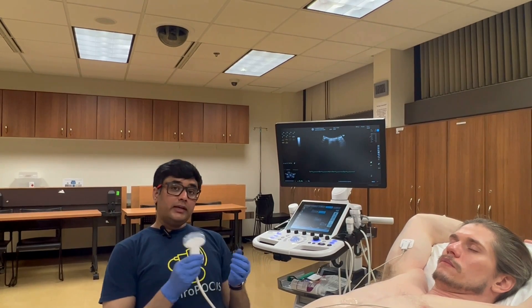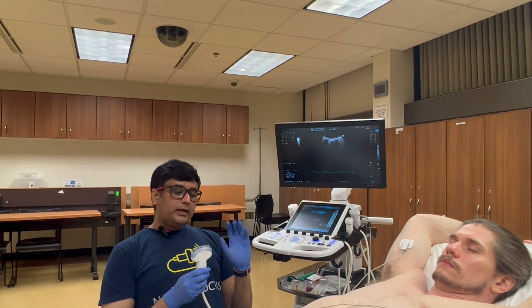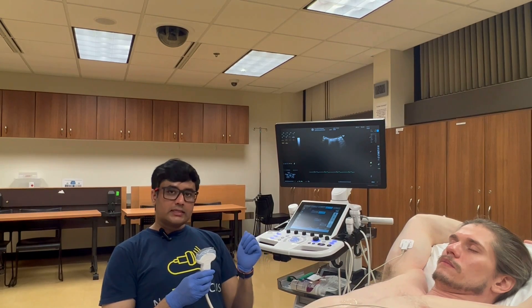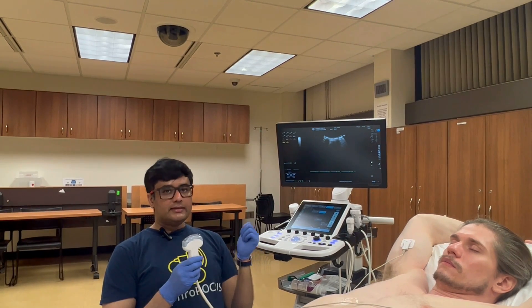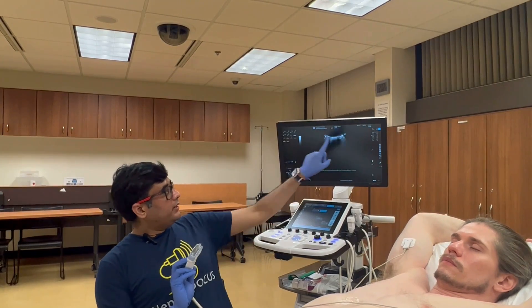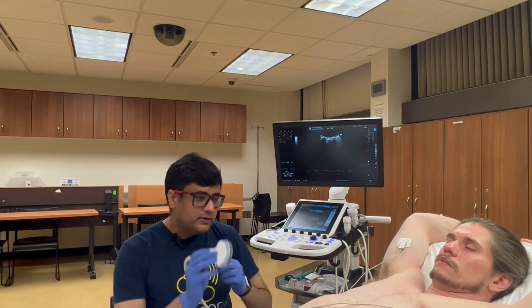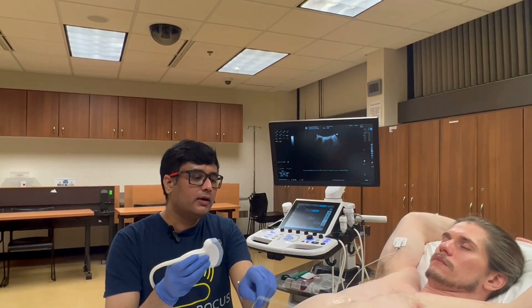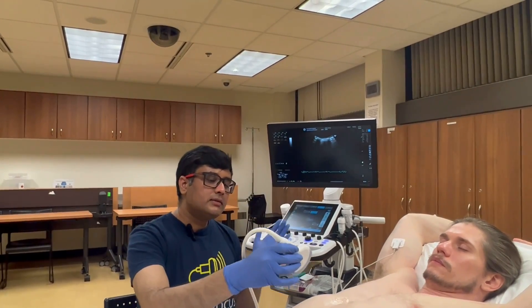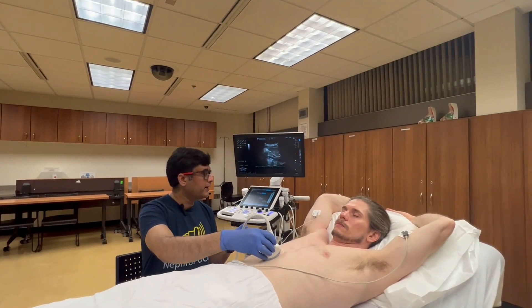When using the curvilinear transducer, put it in the cardiac preset. It depends on the machine, but my machine allows the EKG to run simultaneously only when it is in the cardiac preset. So let's scan the IVC, which is the first step in VExUS. I have already hooked up the EKG leads and I'm placing the transducer in the sub-xiphoid area with the orientation marker towards the patient's head.